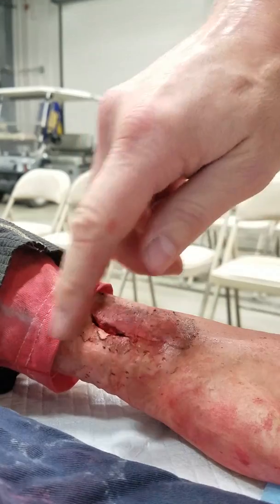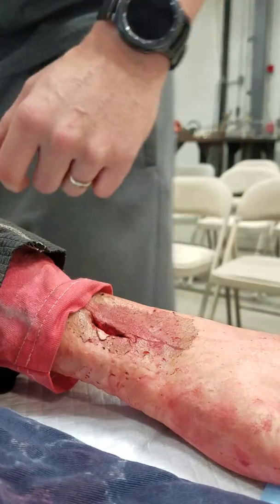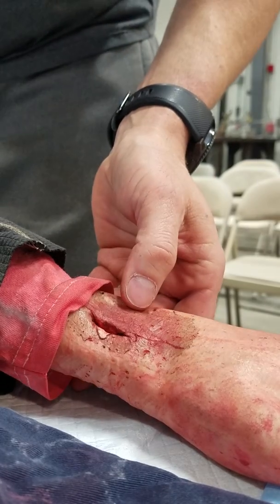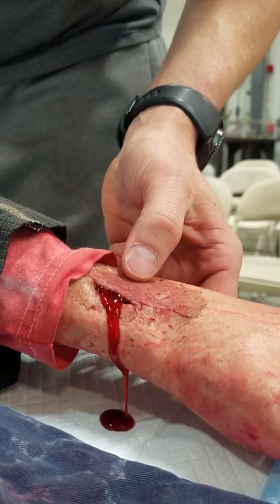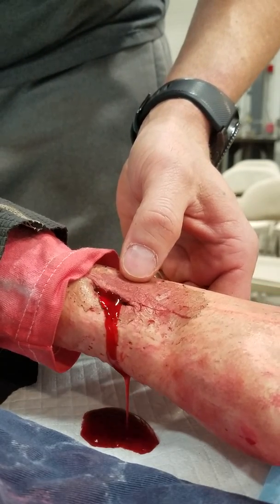Here is the close-up of the left wrist of the simulator. We're going to simulate bleeding from veins, which is identified as dark red in color and having a steady flow. And so here we go. This will be pretty representative of bleeding from the veins.